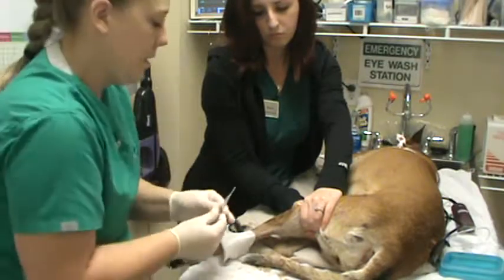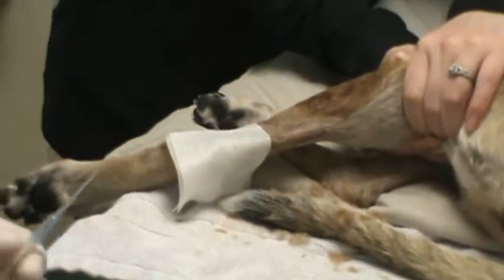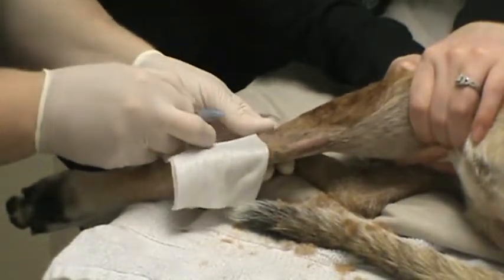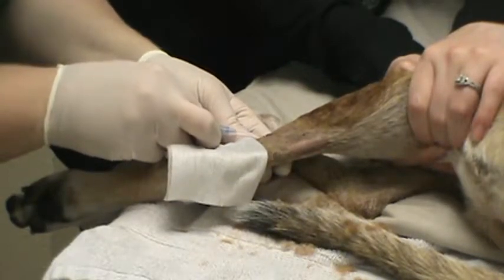And we're going to go ahead and try to put it in our patient here. Okay, so I have my assistant holding off that vessel, and I'm going to place my thumb next to it to try to keep it stable. Inserting the needle.